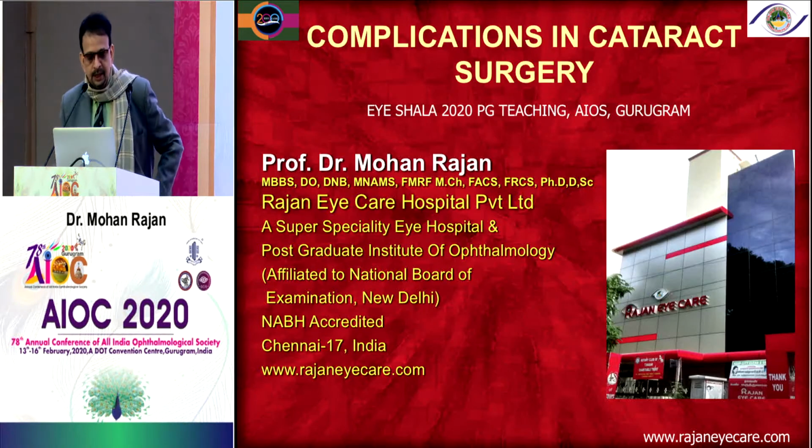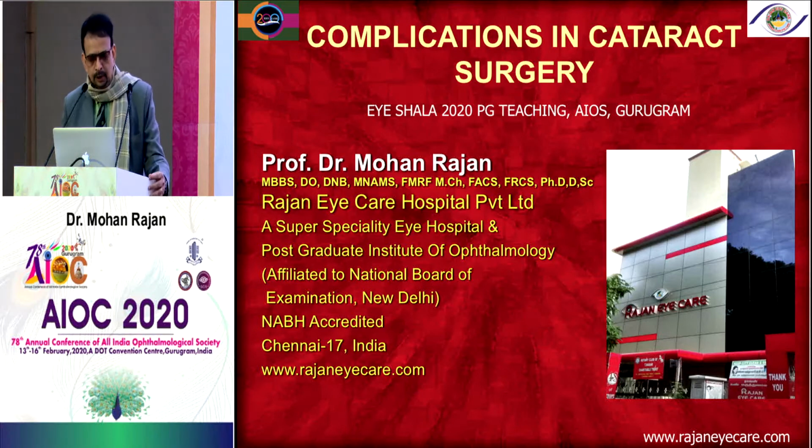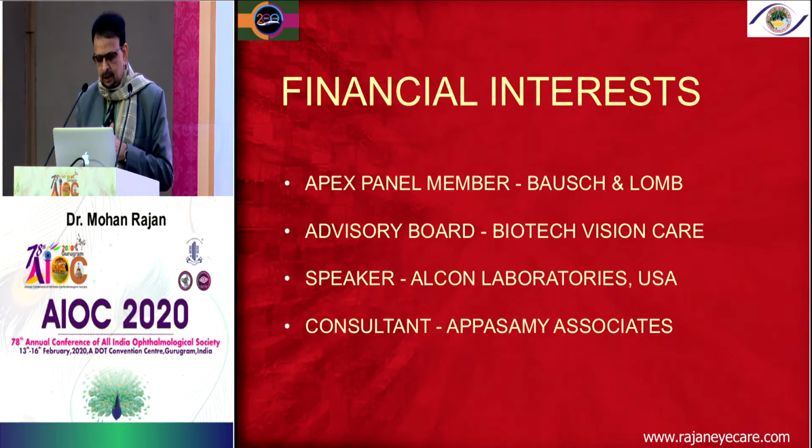And complications in cataract surgery, I'm going to take you through quickly some videos which probably will interest you, and some complications you might have faced in your practice, some complications you will definitely face. Most of the complications I am going to describe, you will face during your surgical practice or during a residency program as well.